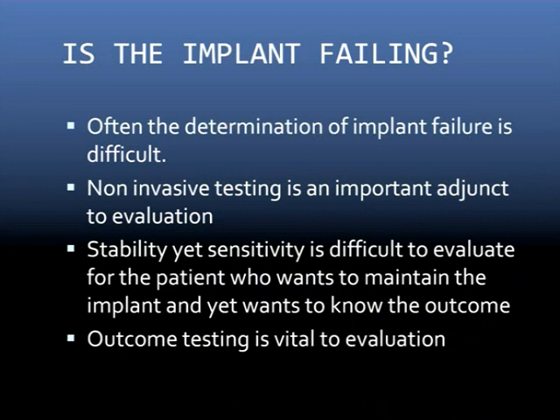So the other area that I find helpful for me is trying to understand about the failing implant. And it's often difficult to determine implant failure. Most of the time in our area of the world, the patient comes back and talks about discomfort. And, well, you need to have some way to do some type of non-invasive testing, I think. And the stability many times is there, but yet there's sensitivity. And the idea is to understand why the sensitivity is there.